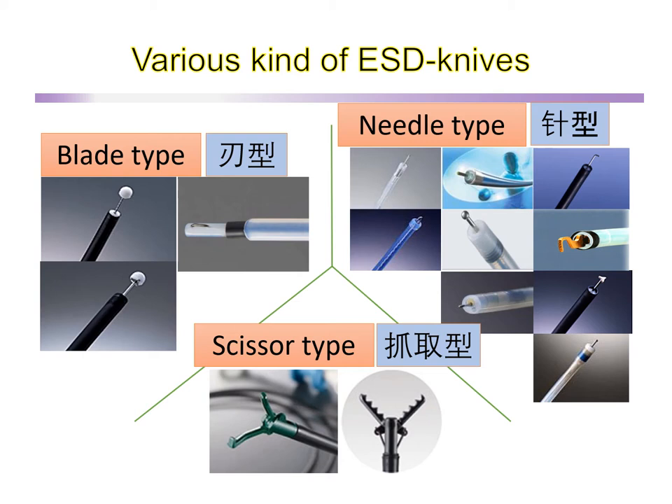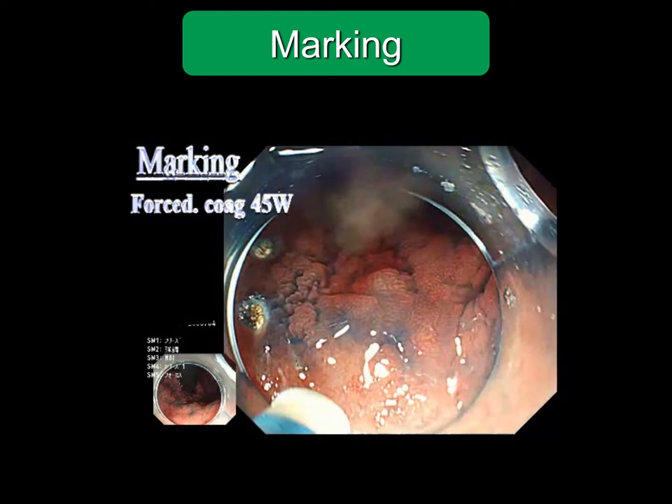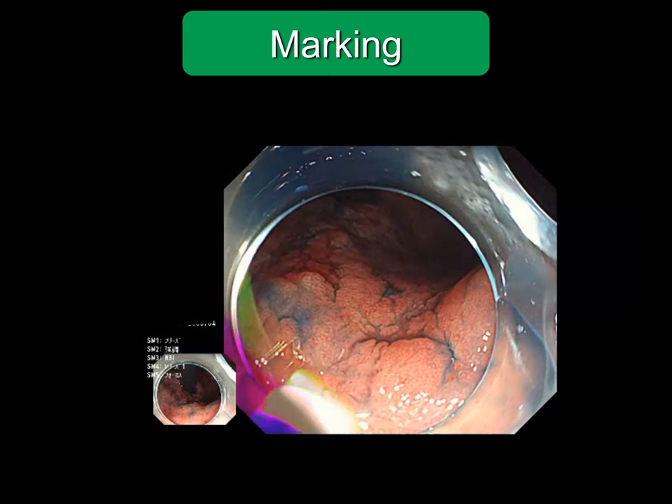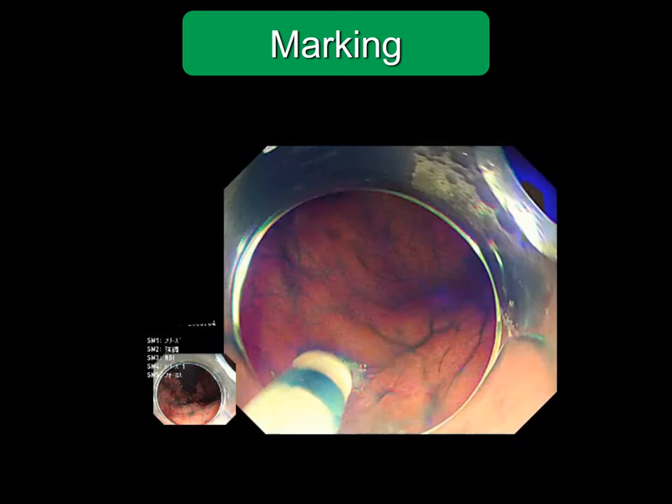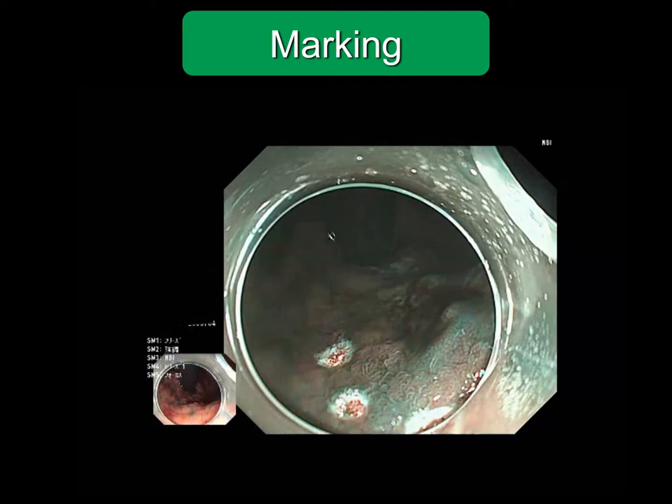In my opinion, you should use your favourite knife. Marking is performed using the tip of the dual knife, like this. I use the coagulation mode. For the esophagus, the soft coagulation mode is safe. For the stomach, I use 45 Watts of the forced coagulation mode.